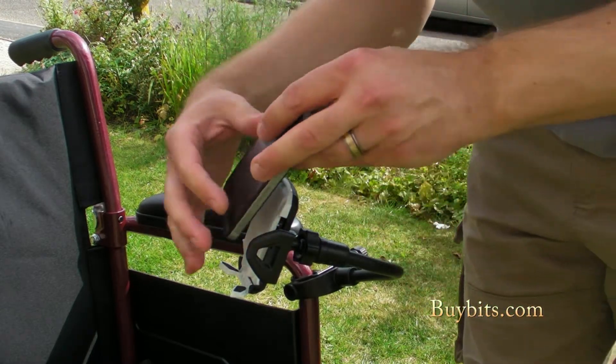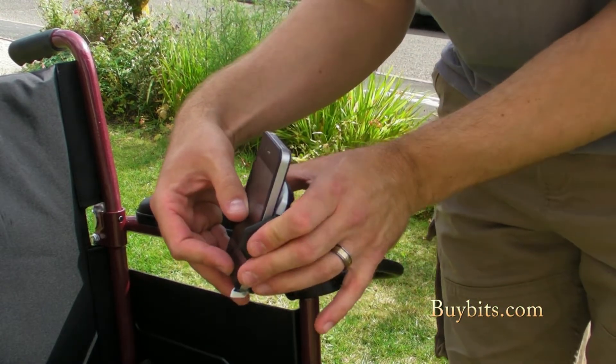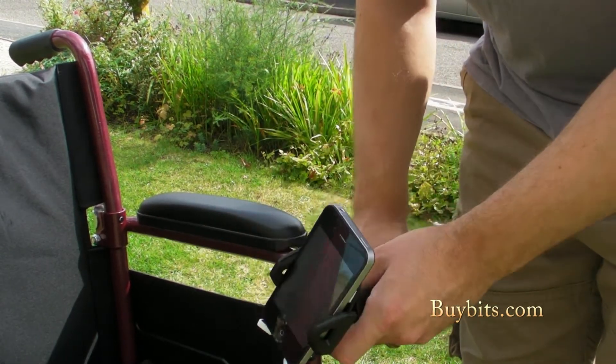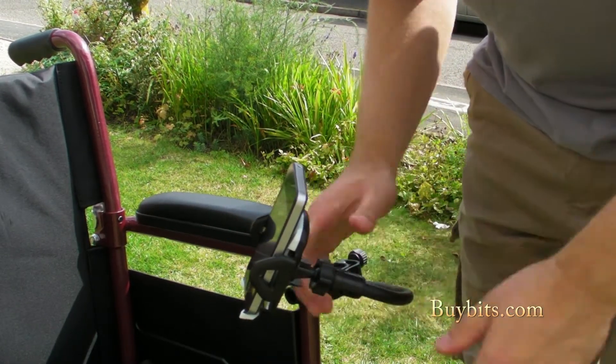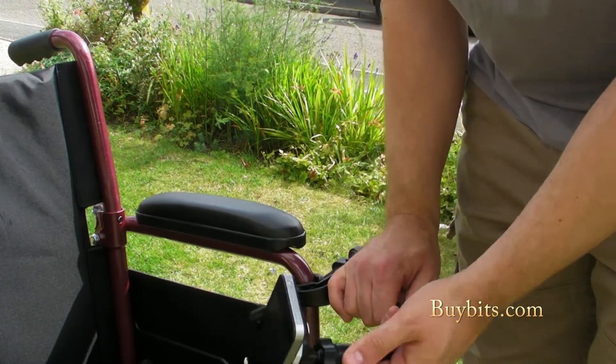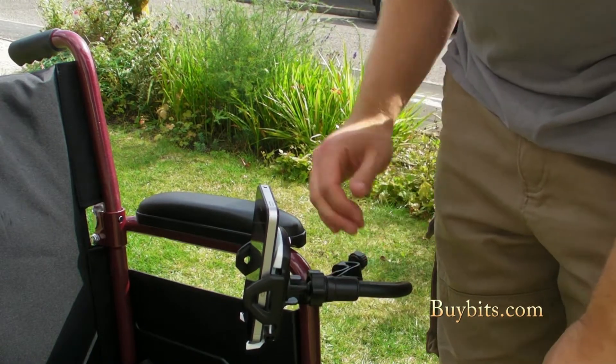My iPhone, which I'm going to slot in here. Any number of devices could fit — any sort of phone, or a sat-nav if you do a lot of miles on your wheelchair, then that's perfect. And there we are, nice and simple. You can still adjust it anywhere and it's not going to fall out — it's nice and secure.